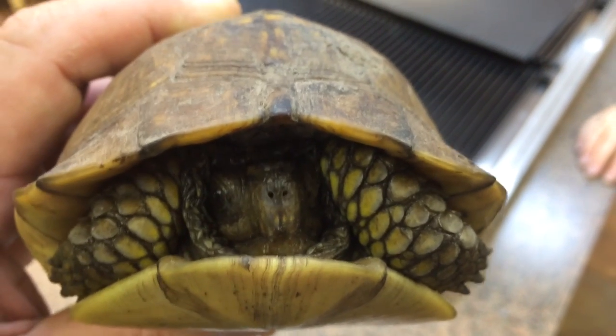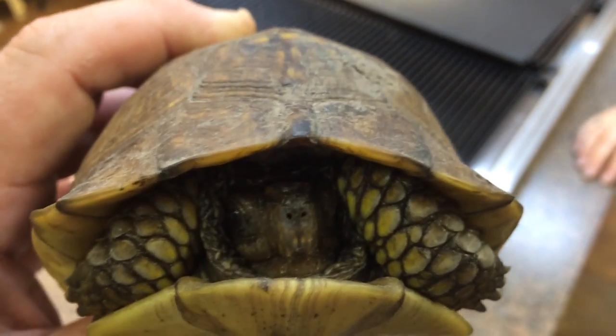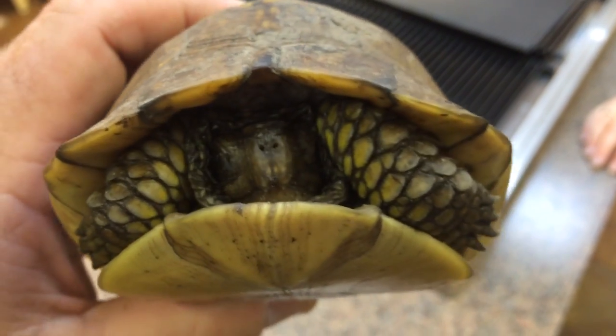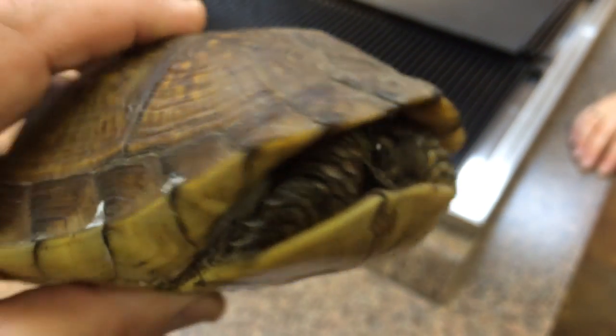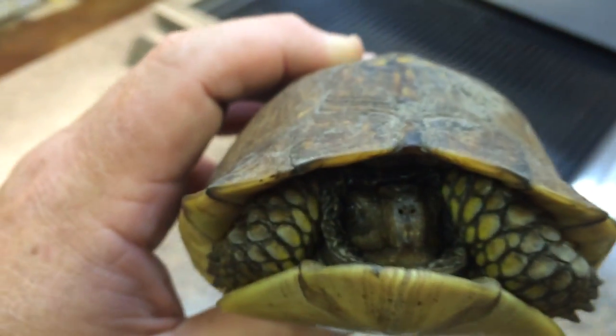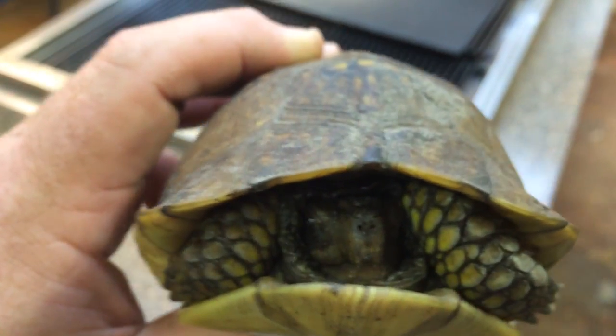The pouch probably holds about half a CC, so we'll keep it clean, get rid of the maggots, and eventually it will hopefully be fine. We added some x-rays and this turned out to be a really cool case. I thought maybe if the maggots were still around I could raise them, but they threw them away.